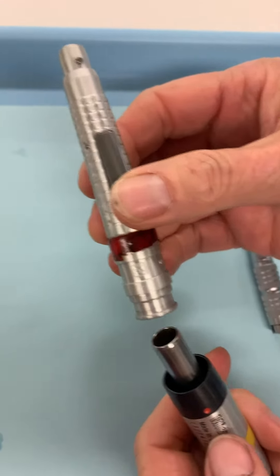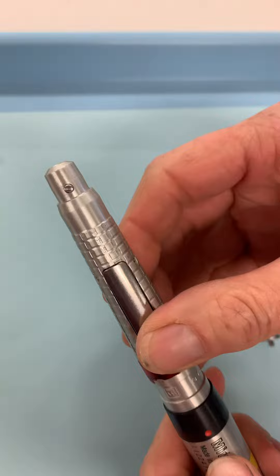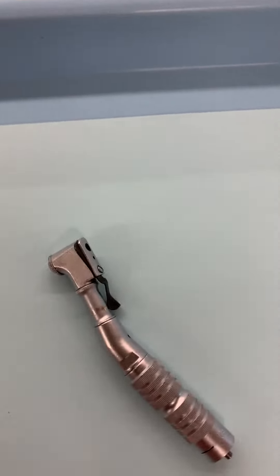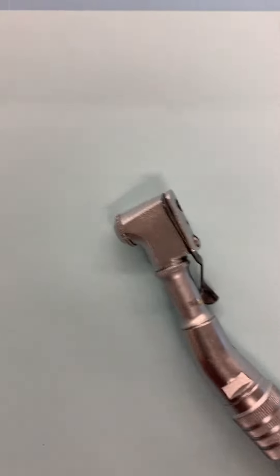On the slow speed motor you can put different attachments, whether it be the straight or the contra angle. Let's look at the contra angle now. The contra angle has a latch on the backside.